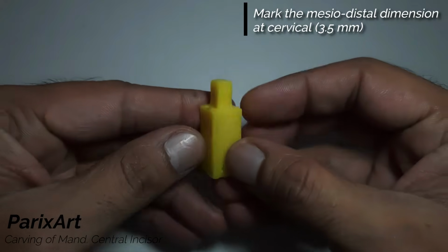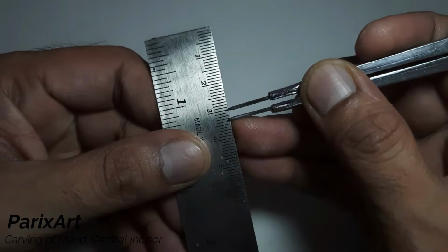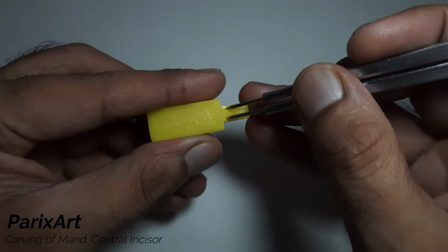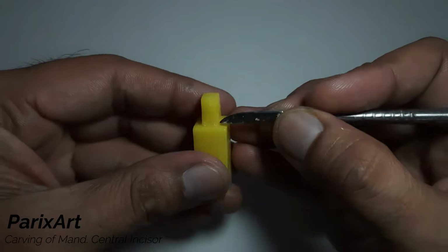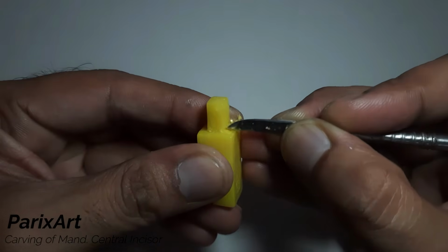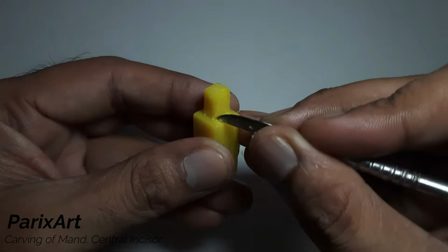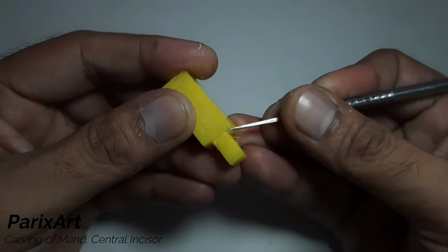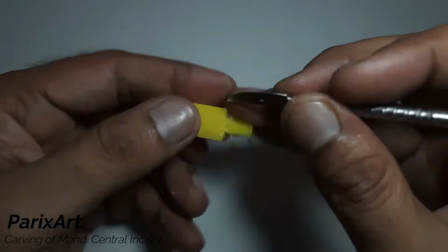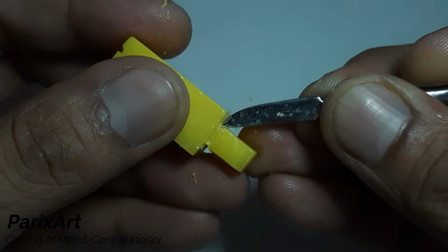Now we'll mark the mesio-distal width at the cervical, that is 3.5 mm on the labial as well as on the lingual. Mark the notches at these markings as we have done earlier in the carvings, extending them labio-lingually. Keep them very neat.